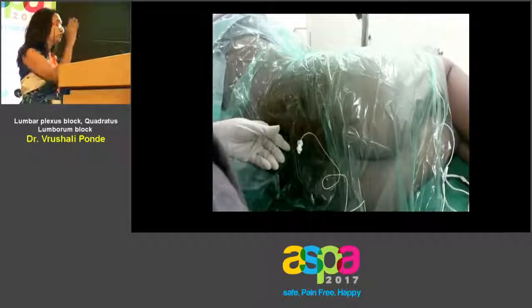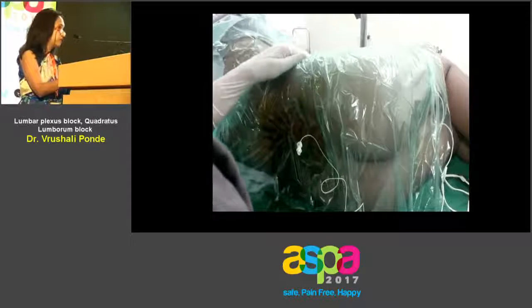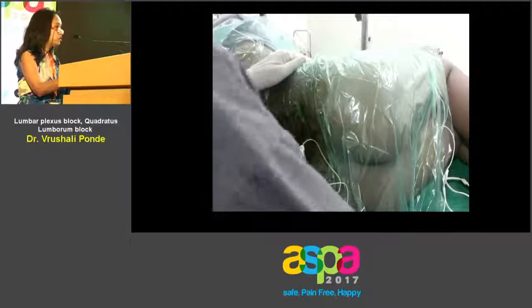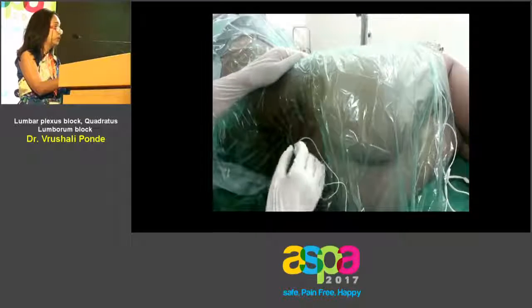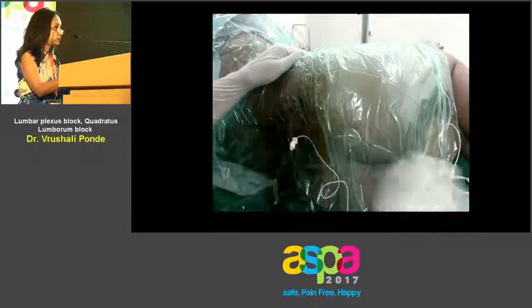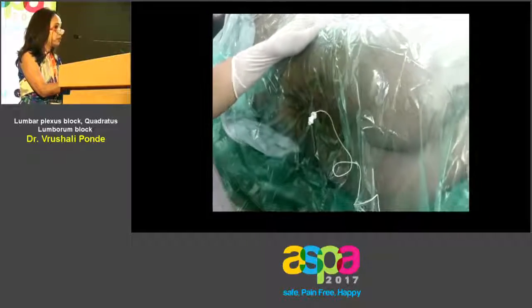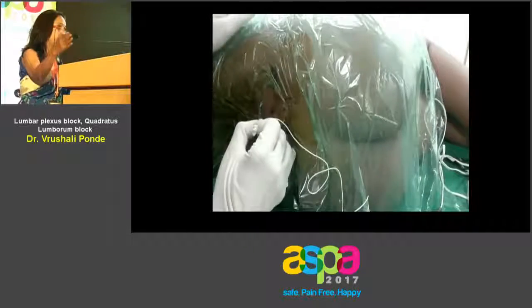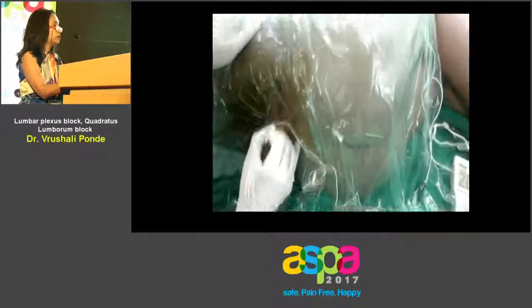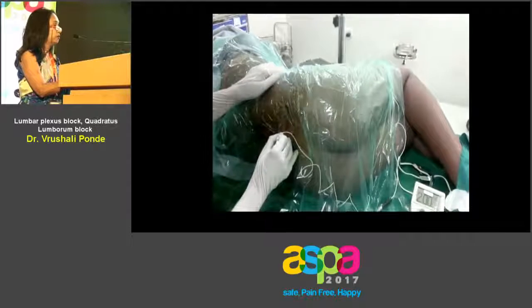This probably is going to show us every step and where we could go wrong with identifying the stimulation. This is an extremely superficial stimulation, needs to be ignored and go ahead with it. As we go deeper, these stimulations are going to vanish. And if we get the stimulations on the posterior aspect, in fact, probably we are more towards the sacral plexus than the lumbar plexus.